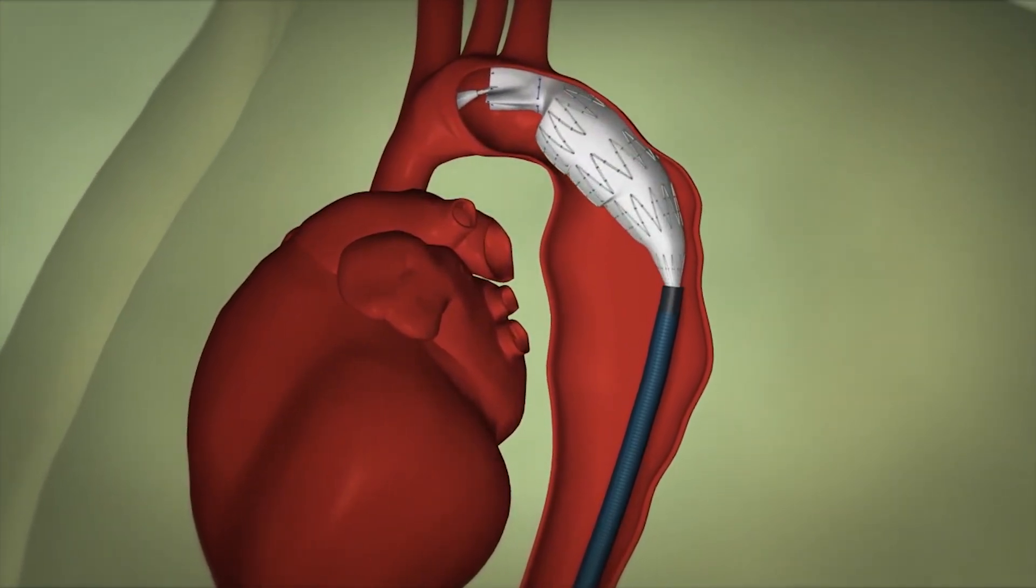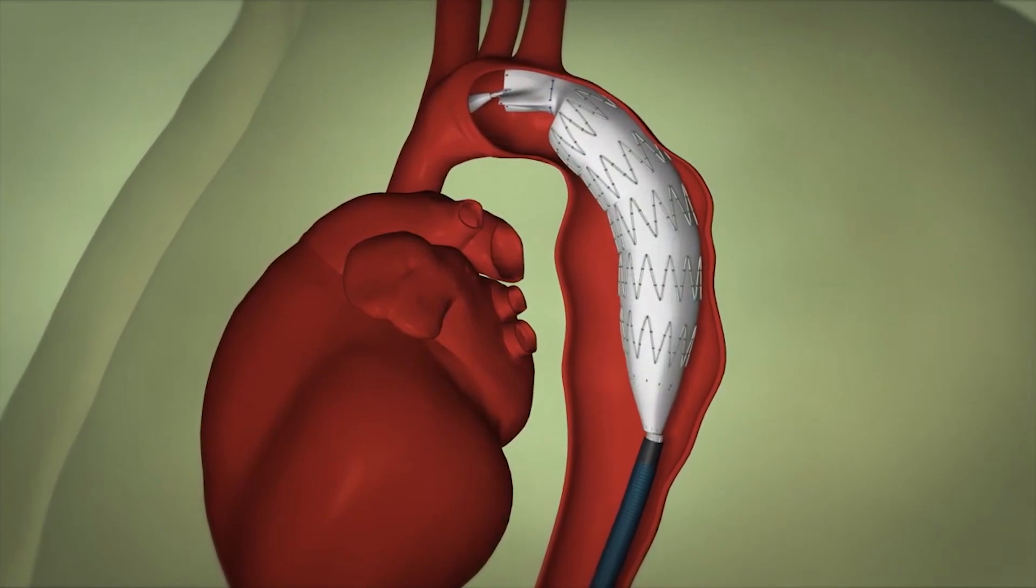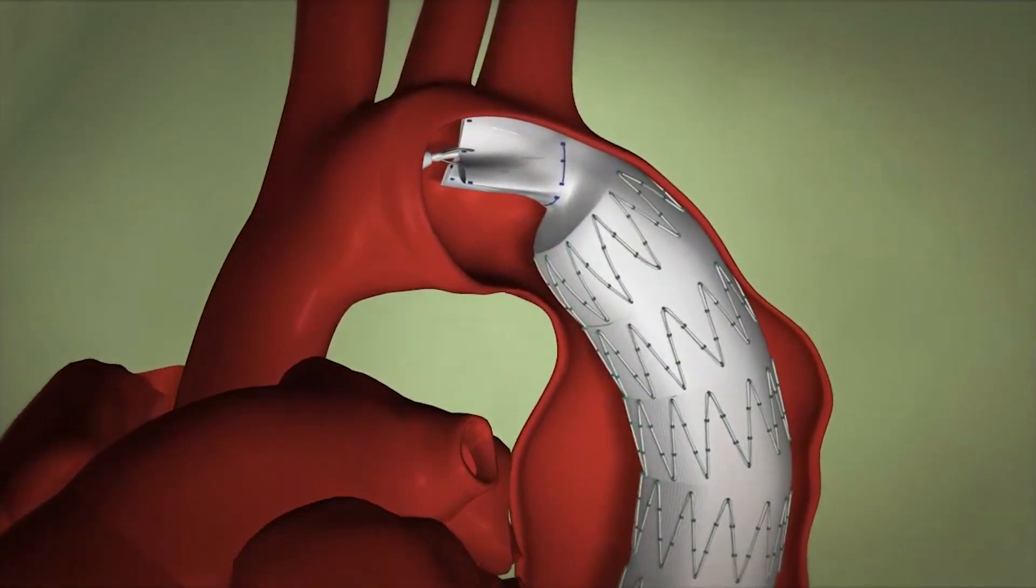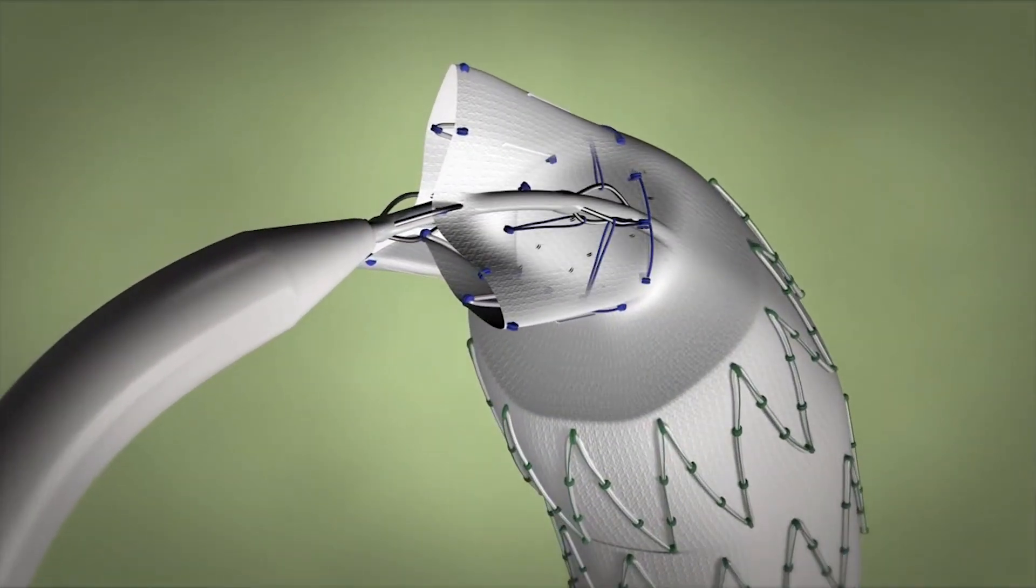Using contrast and a special kind of x-ray called fluoroscopy, we are able to confirm the correct position of the device and slowly deploy it.